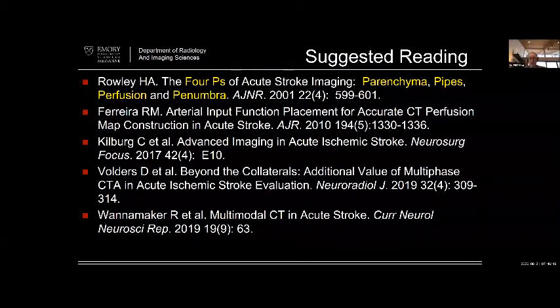I agree with you. At UCSF, we do not report out ASPECTS necessarily because of the variability that has been defined between observers, and we're concerned about that. That said, just as you say, depending on the timing of the stroke, it can be quite difficult to know.